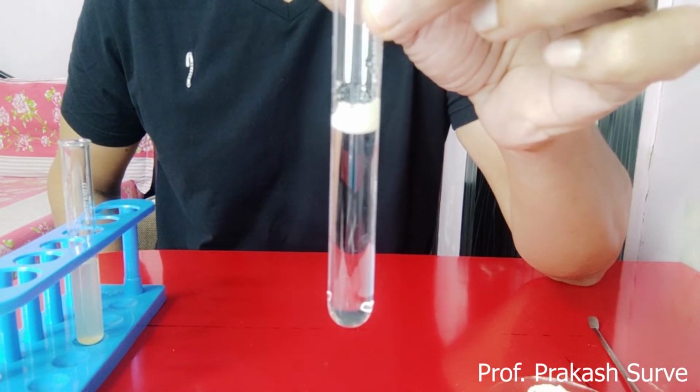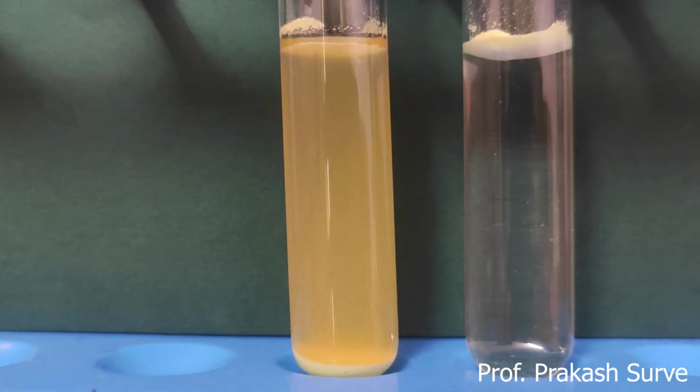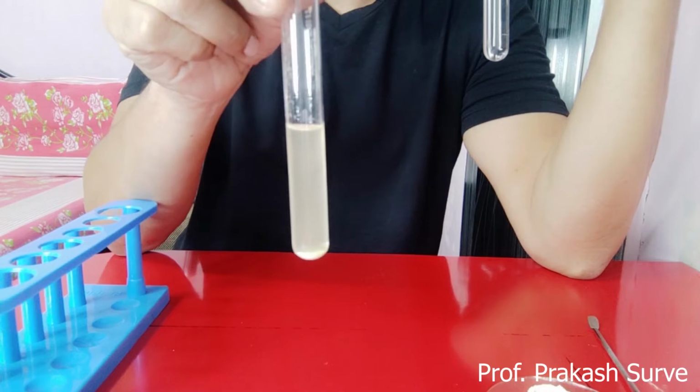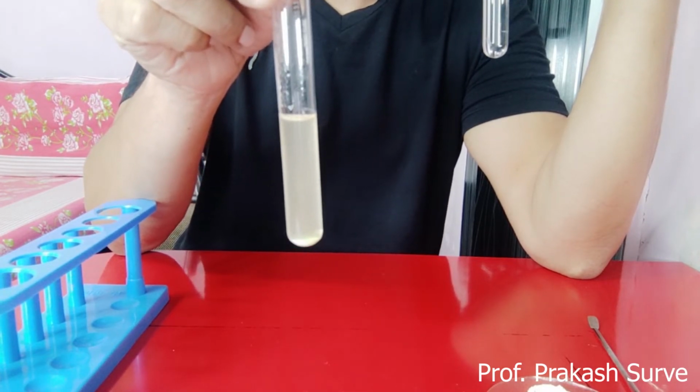So you can see the difference between both. Here in this, the sulfur powder sinks down, and in this the sulfur powder is floating. So in this test tube, whatever urine sample is there, that urine sample is considered abnormal. It means it shows the presence of bile salt.